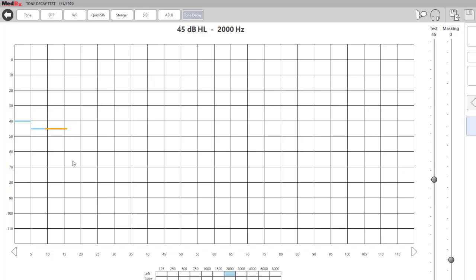If they no longer hear it, the test will automatically move up in intensity in five decibel increments for about five seconds, and then it will increase again if there is no response by the patient.